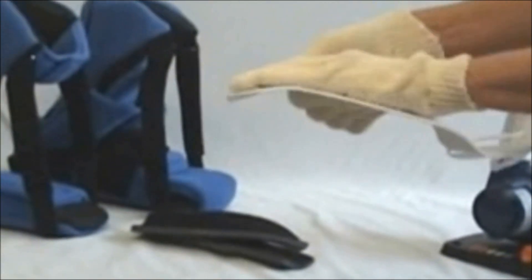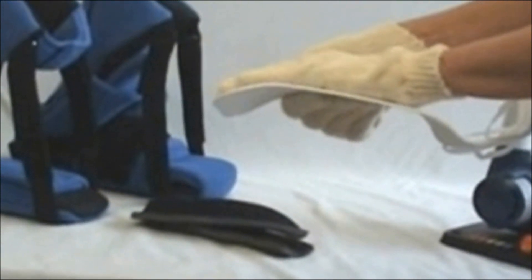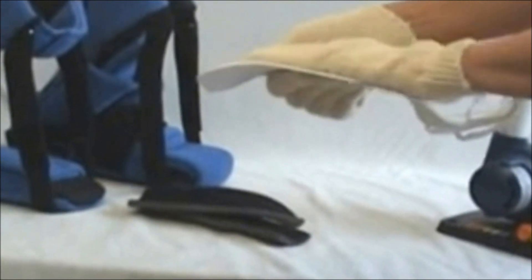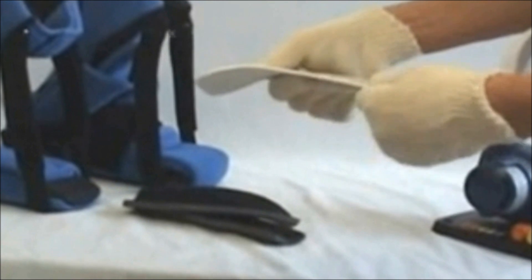Now if you have an arch deformity, again heat that. You're going to make it meet the bottom of the patient's sole with just 5, 10, maybe 15 degrees. Just a little, like where you could put your finger under the patient's foot. This allows the tarsal bones to start loosening up, working through that tone to help them relax.